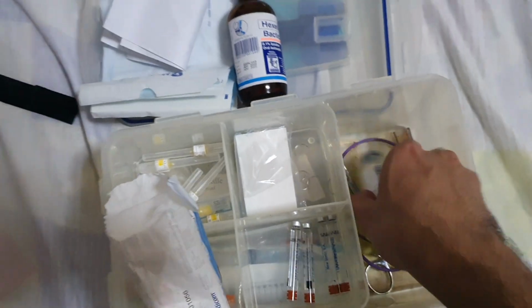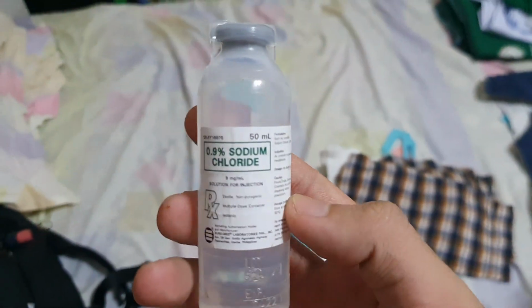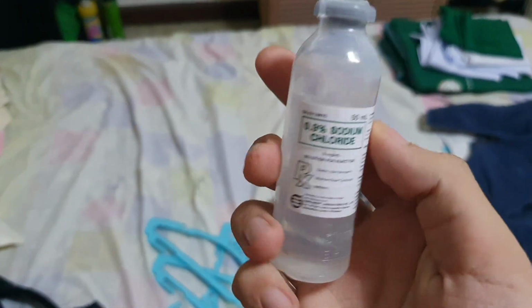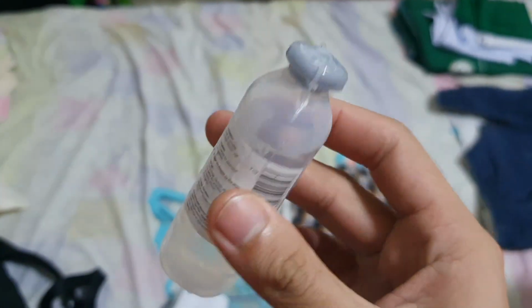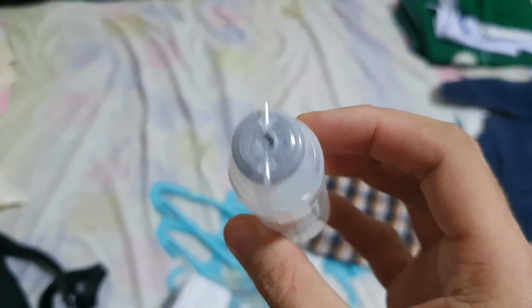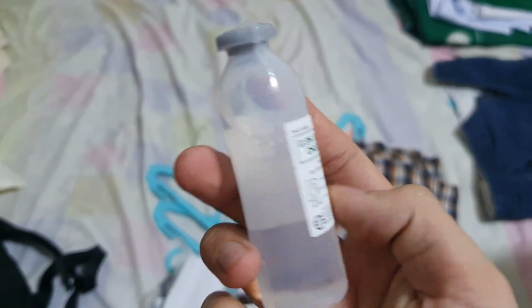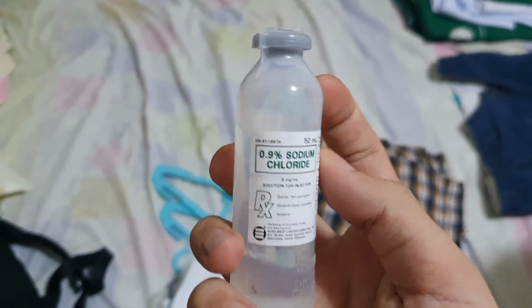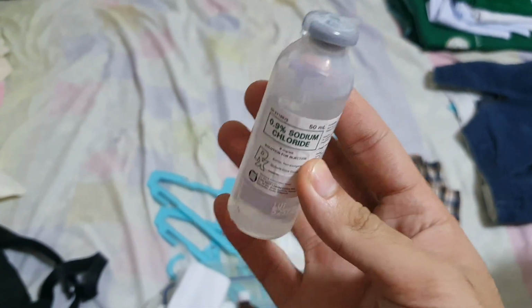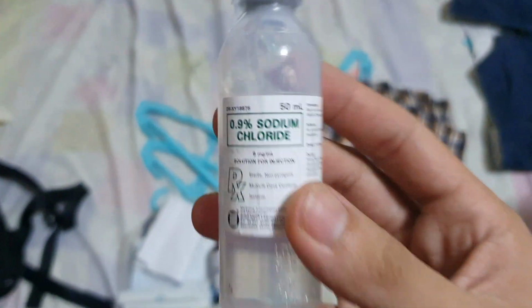And of course the sodium chloride or the NSS. After we do the extraction, the tooth has been pulled out. Okay, we're going to use the normal saline solution to keep the extraction site clean. It's very, very important also in dentistry, sodium chloride.